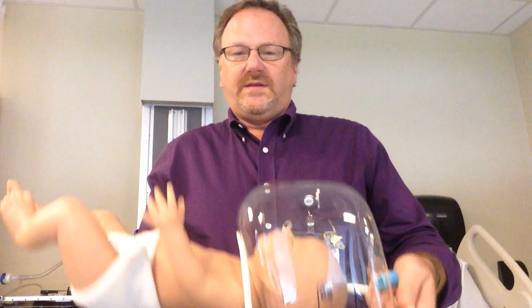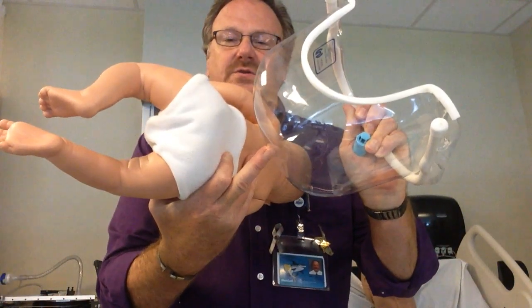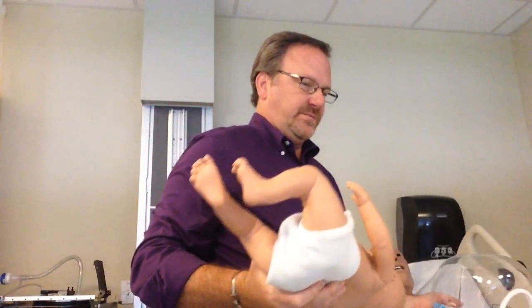The oxy hood goes on like this. You can have an FiO2 detector placed on it to determine the actual FiO2 being delivered. The minimum liter flow is seven liters per minute.